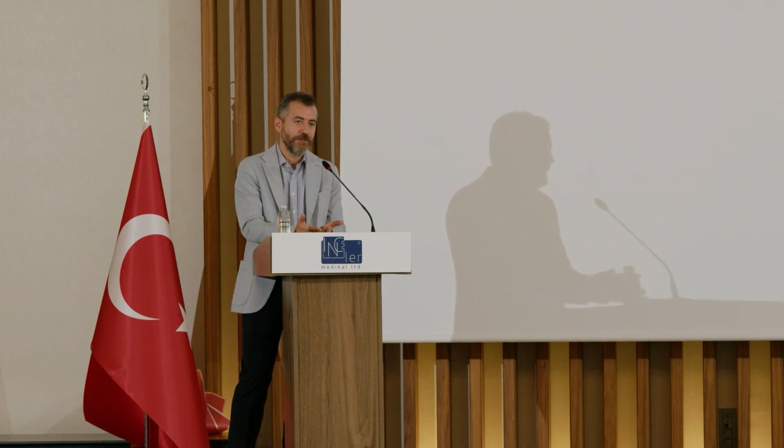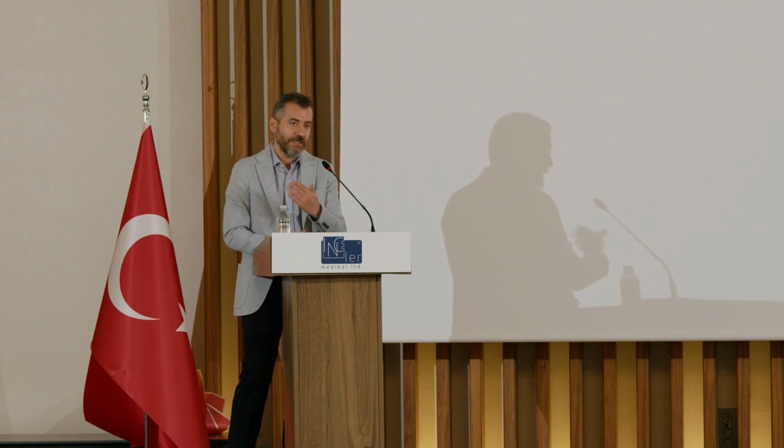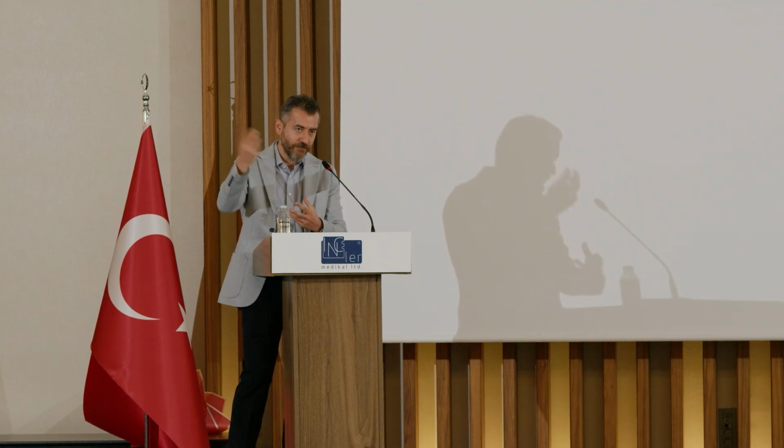So, what I do is, of course, there's a risk, especially in dilated systems, that the stone fragments can go anywhere. But it's not a problem of only ballistic lithotripsy, it's also the case with the holmium laser as well. And also during ultrasonic lithotripsy, it can still happen because you fragment and you suck out the fragments, but in the end, some of the fragments can go anywhere inside the collecting system. And what I do is at the end of the procedure, I check the entire collecting system with a flexible ureteroscope. And if there are any residual fragments, I just take them out with the basket.